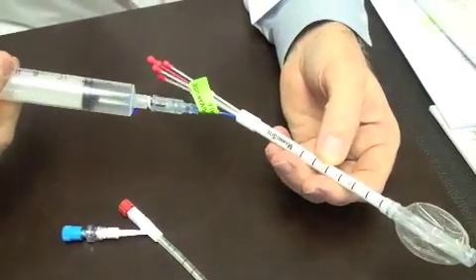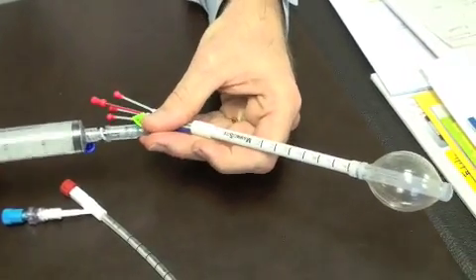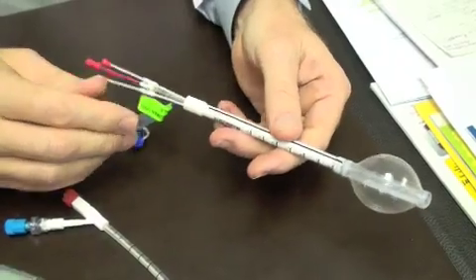We place the balloon in the patient's breast in the office here, and we secure the balloon catheter.